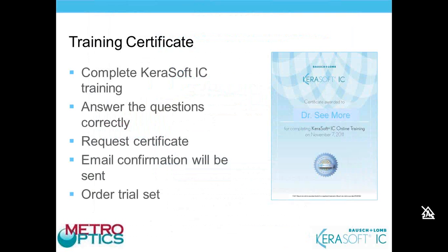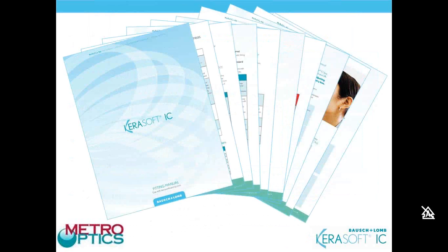At this point, you will be able to order the trial set from Metro Optics. There is a paper fitting guide, so you don't have to remember everything from all the videos. And while we all know how to fit soft contact lenses, this one is a little more involved because you're fitting irregular corneas with it. So the fitting guide is actually a great reference in addition to the training modules, just when you're getting started fitting this lens design.